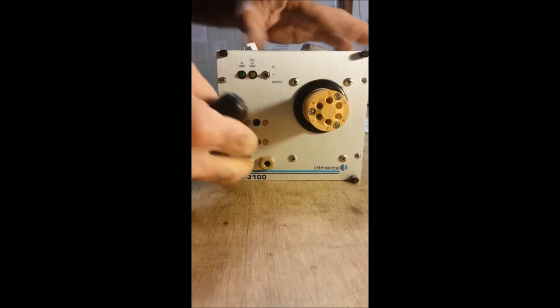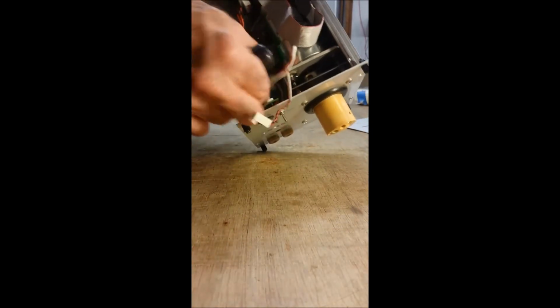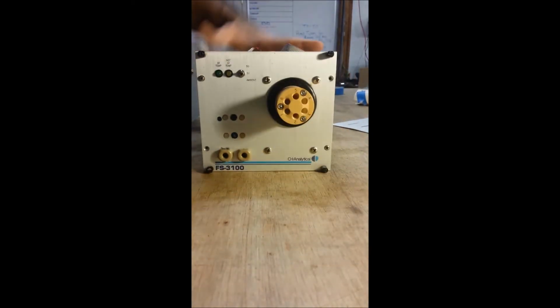Always want to make sure that the bottom plate stays in. And I usually do the opposite sides. Always making sure that I do the opposite two screws, because once you get two of them in, it tends to stay. And you always want to make sure that you haven't pinched any cables anywhere. And then go ahead and finish off with all the screws.